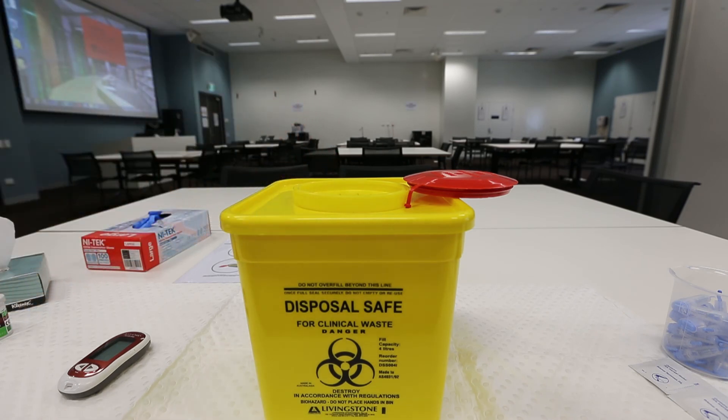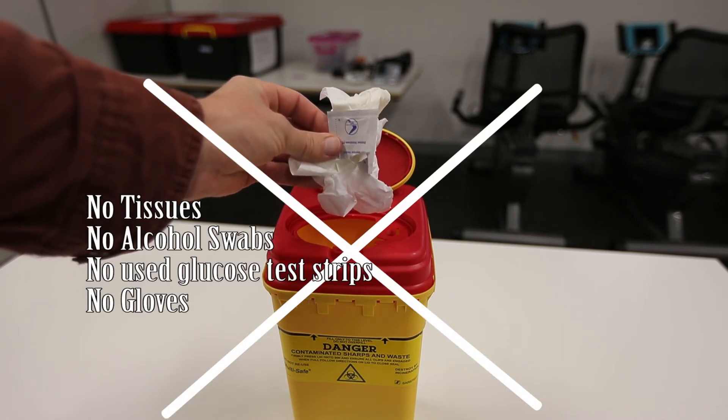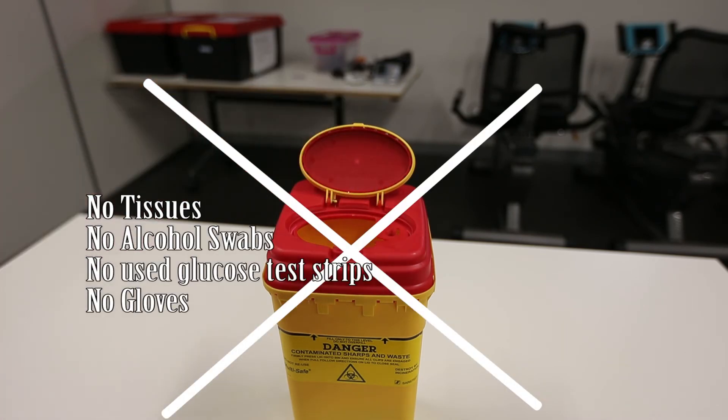Place your used lancet into the yellow sharps bins. Now there are three things to note. Firstly, please don't put any tissues, alcohol swabs, used glucose test strips, or gloves into the yellow sharps bins. Only your used lancets.